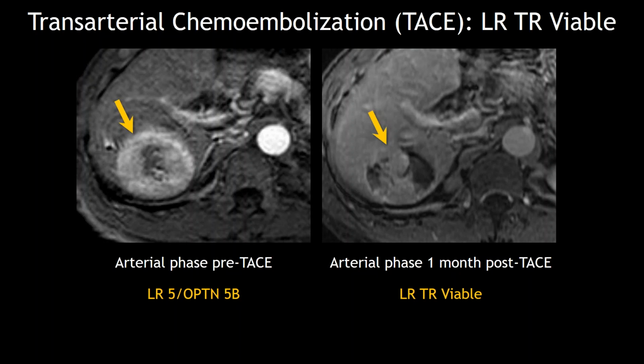This one, the post-treatment image. I don't see it as an arterial phase, because the aorta is not really bright, and the lesion was hyper-enhancing. There was a perfect arterial phase hyperenhancement before treatment. I don't see this APHE post-treatment. Why didn't we call it equivocal, at least, not viable? Maybe the phase is not correct, or I don't know. Yeah, you're right. Unfortunately, I didn't have the right phase here. You can see the aorta here and here. I wrote arterial phase, but this is actually probably more of a portal venous phase, so I should correct that.